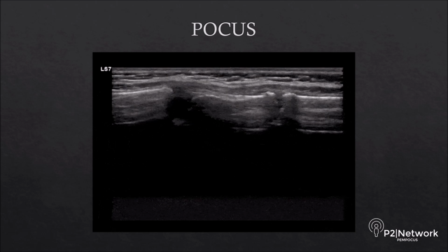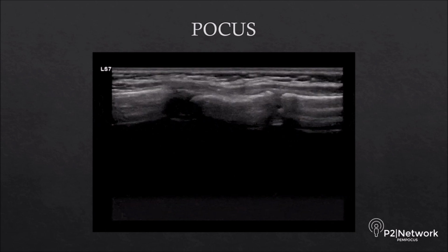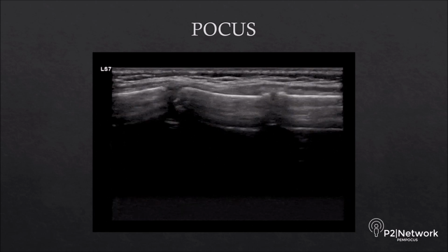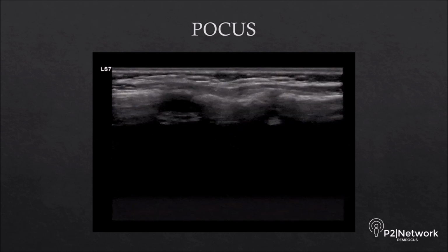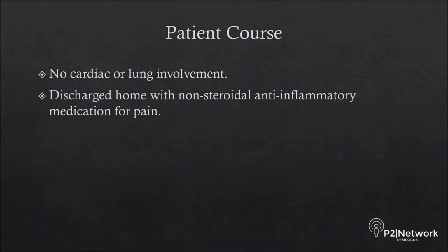On ultrasound, you can see on the right that she caused herself a buckle fracture by that hyperflexion injury. The heart, cardiac, and lungs were normal on POCUS, and she was discharged home safely with NSAIDs and strict return precautions.